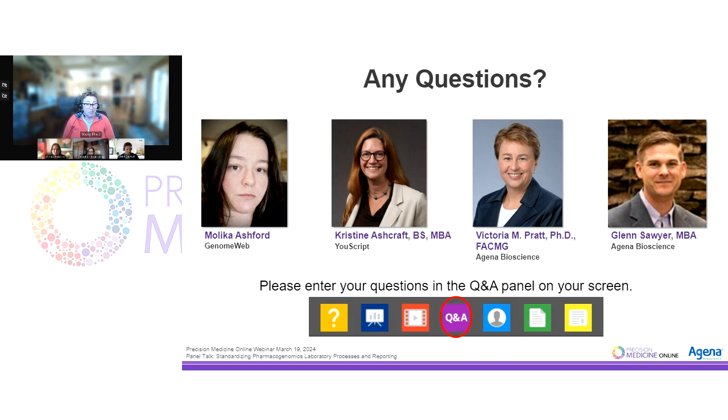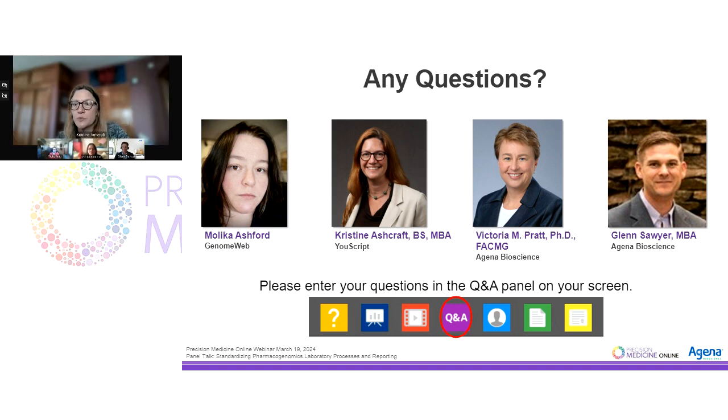And so somebody who got our PGX test when we first started the lab, while much of the content was there, more than 80% of the content didn't change. There was probably some of that 20% that did change and evolved over time as knowledge evolved. Yeah, I would just say future proofing. I mentioned it before, but to Vicky's point, you should be set up to make updates at least once per year if you are doing pharmacogenomic testing.